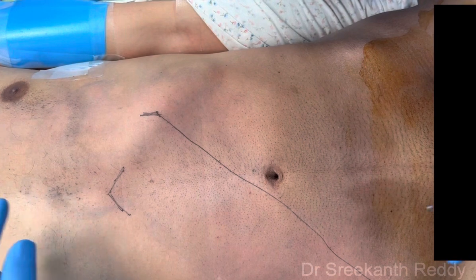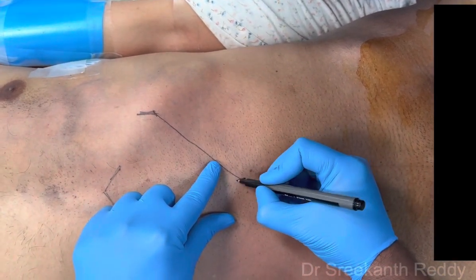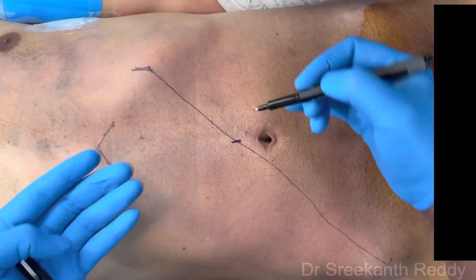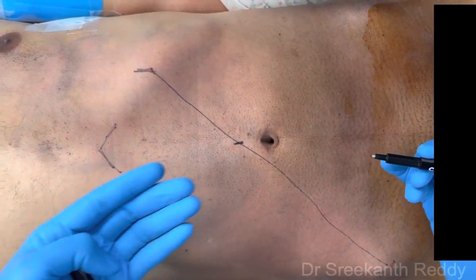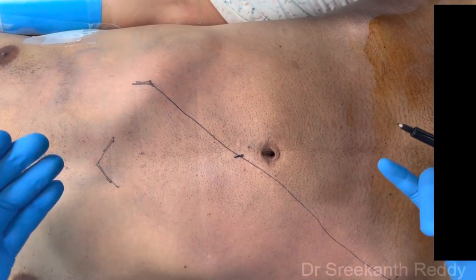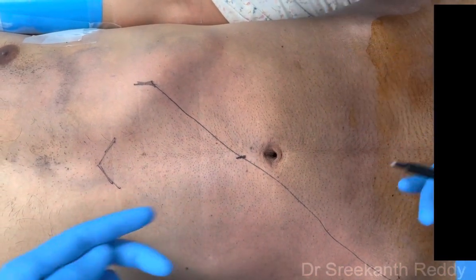This can be done by a single docking method. First, we put a camera port 1 cm above the umbilicus. In laparoscopic surgery you give a 4-finger breadth margin, but in robotic surgery 8 cm margin is preferred. This is a normal abdomen — in case of an insufflated abdomen, even though it is narrow, you will get more space.